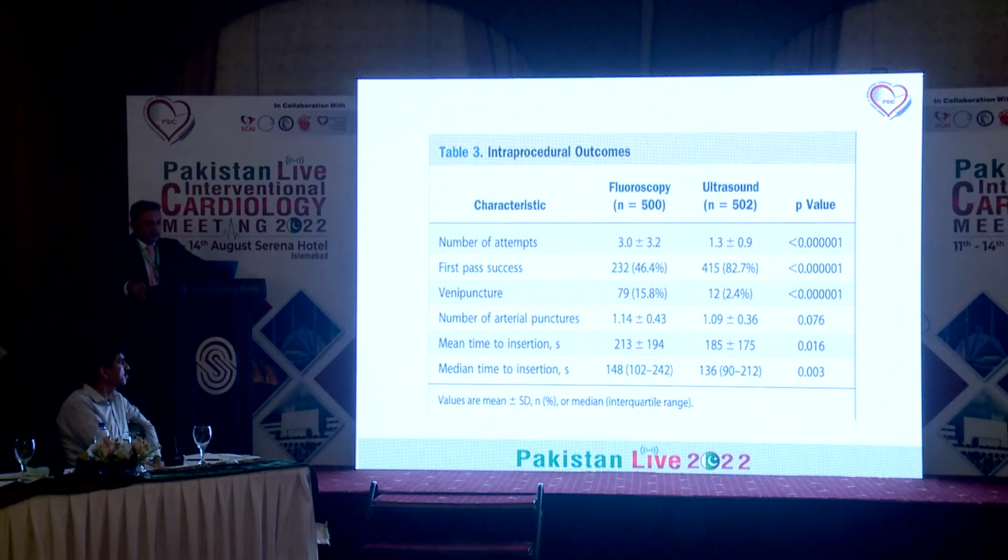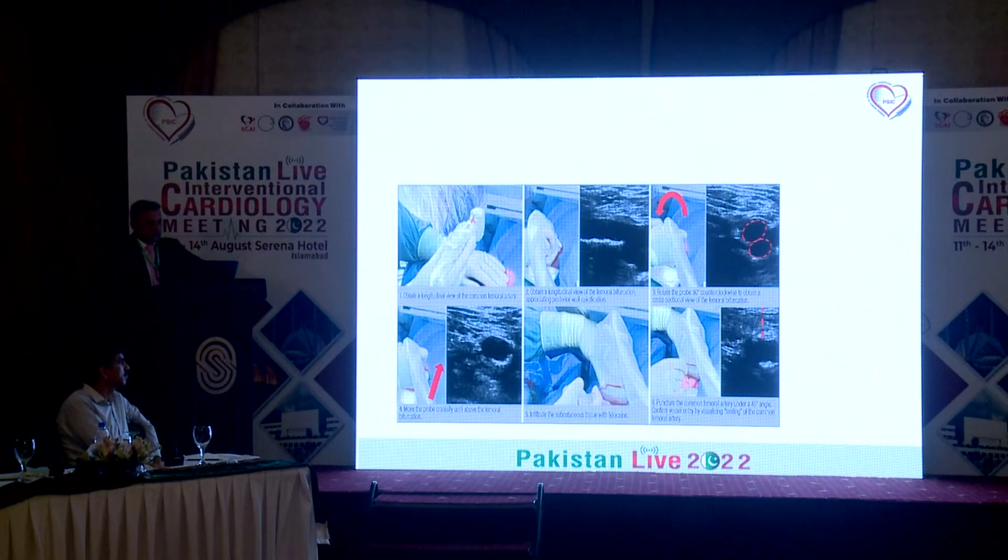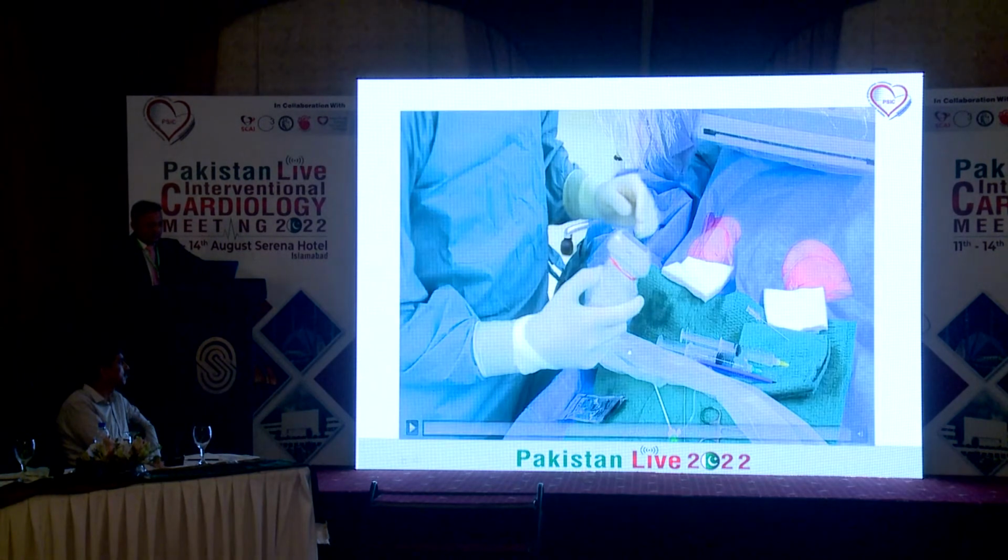Again, the number of attempts with ultrasound was less, first pass success was high, and venipuncture was less with ultrasound guidance. There was less hematoma seen with ultrasound guidance, and this is how it is done. I will show the video.